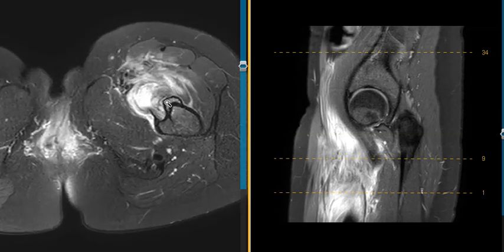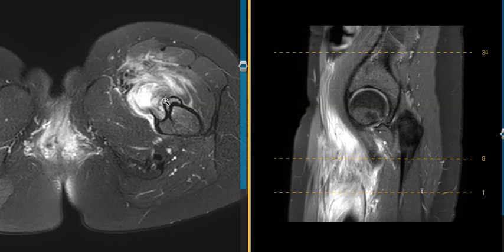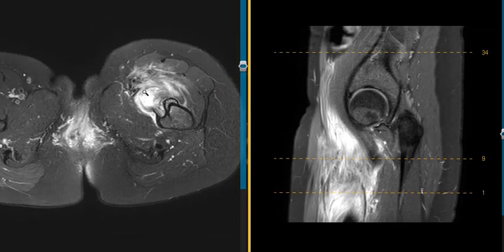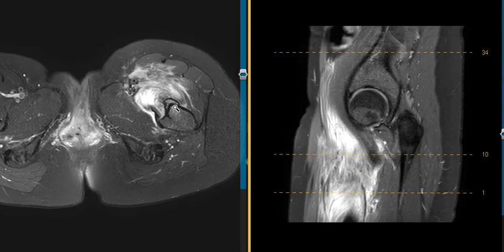There's new bone. This little area right here is periosteal new bone formation. This is the cortex around the femur, and there's this new area right here — a bone rising from the periosteum right beneath this process. With new bone formation that looks chronic like this, this is an indicator of old trauma. A neoplasm would cause bone destruction.